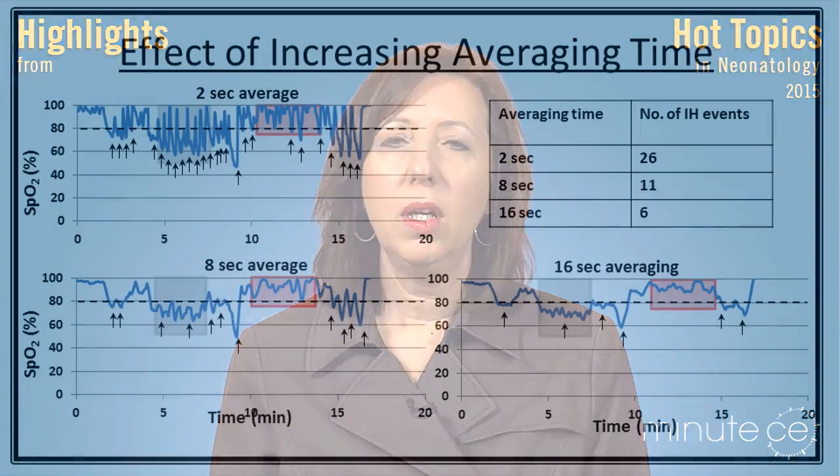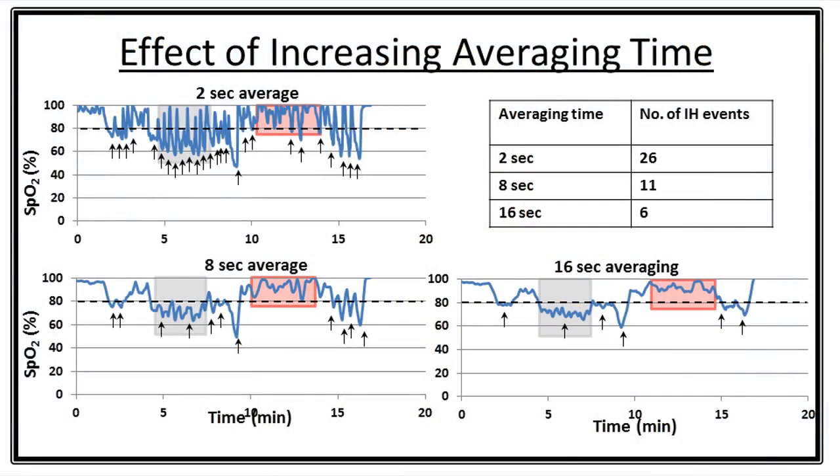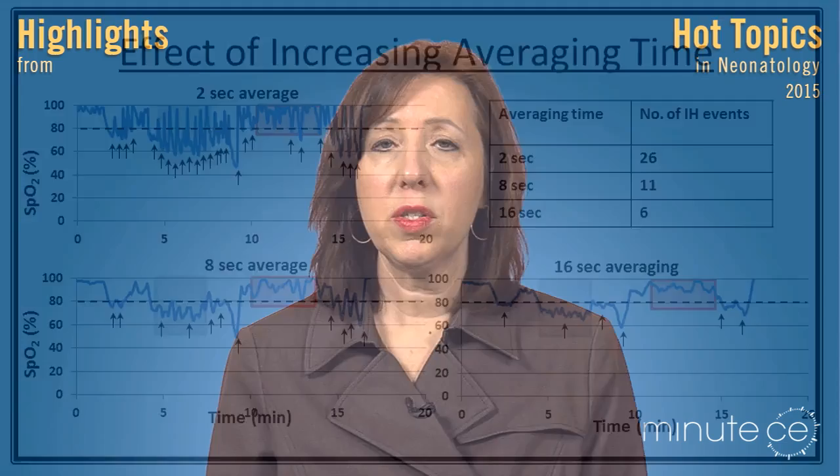So why are we not always using a longer averaging time? Well, a long averaging time can result in unanticipated consequences. For example, in the red box, the oxygen saturation signal is being smoothed in an upward manner above the desaturation threshold. In contrast, in the gray box, the oxygen saturation signal is being smoothed in a downward manner below the desaturation threshold. So a longer averaging time can create false long desaturation events. And this can be problematic as these are the events that we are most likely to intervene on with supplemental oxygen.